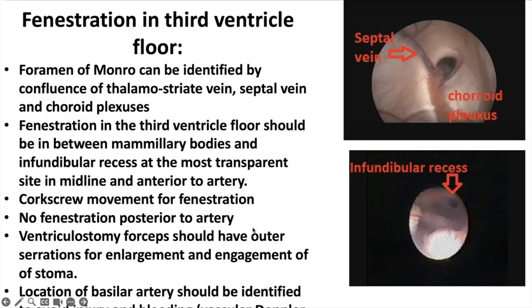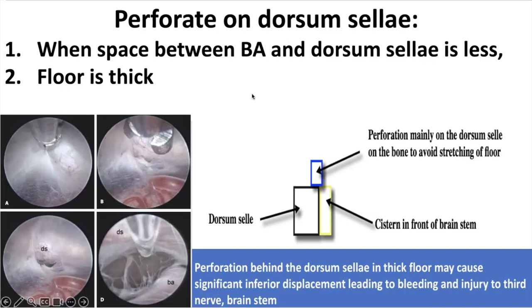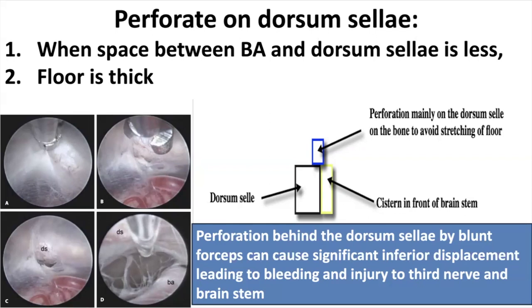Ventriculostomy forceps can be used for enlargement of the stoma and should have outer serrations. The location of the basilar artery should be identified to avoid injury. Vascular Doppler or navigation can be used when there is a thick floor. The end stage of the procedure is a bare basilar artery. There may be a second membrane which should be perforated. Perforation can be made on the dorsum sellae when there is less space between the basilar artery and dorsum sellae — but perforation behind the dorsum sellae by blunt forceps can cause significant inferior displacement leading to bleeding and injury to the third cranial nerve and brainstem.